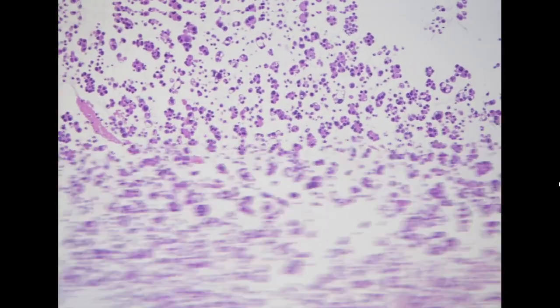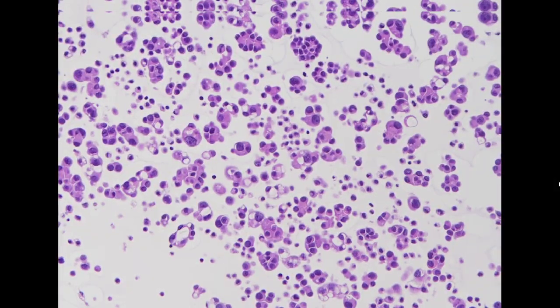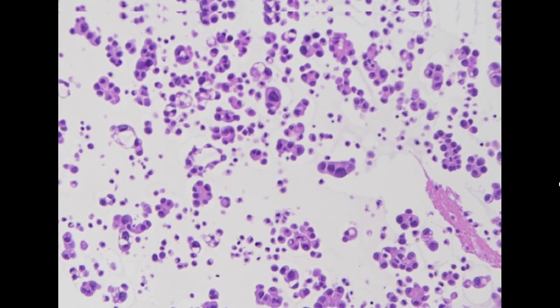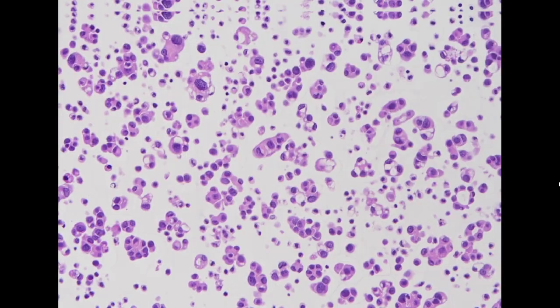In the cell block preparation, it is very easy. You can appreciate these are all tumor cells, most of them. And this is very typical for lung adenocarcinoma with a predominant micropapillary pattern, which is a high-grade, more aggressive histological pattern in lung cancer. You can see this type of pattern predominantly in your pleural effusion specimen.